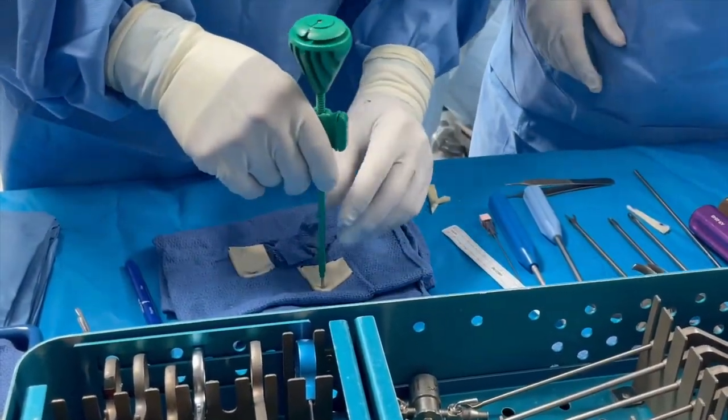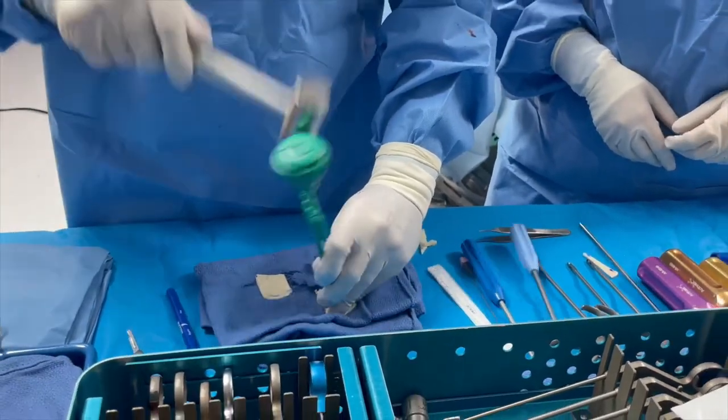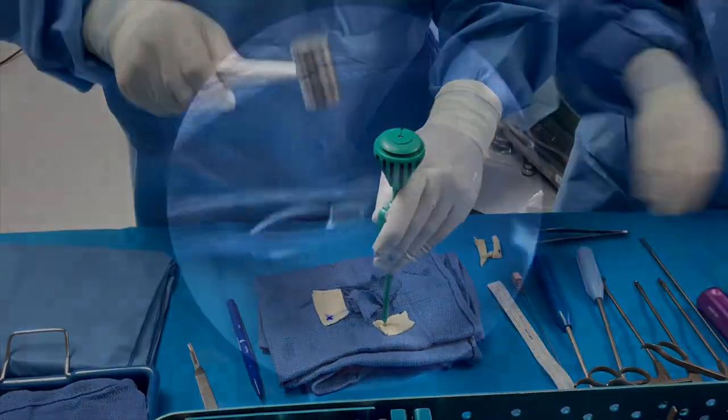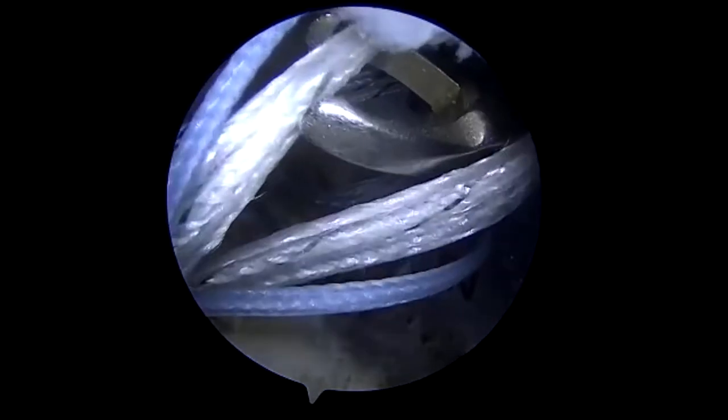We will now, on the lateral side, make entry holes, which later will pass the suture through. This is for the tuberosity side. We are now grabbing the sutures from the glenoid anchors.